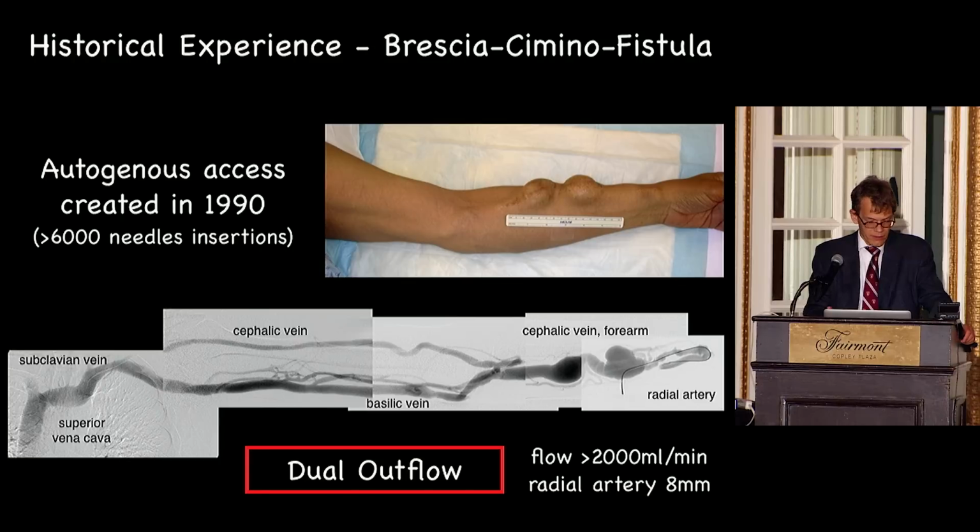You see here the effect of 20 plus years of needle insertions. Yes, there are enlarged needle insertion sites because most arms hang down all the time, and just by hydrostatic pressure, there's a little bit of distension after needle insertion. But the skin is completely intact, still well pigmented. This is a good access.